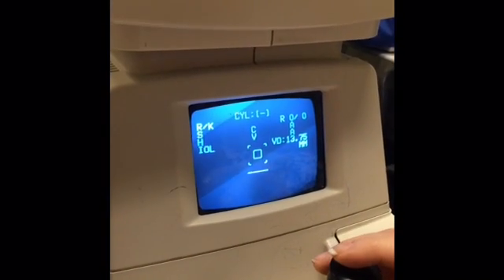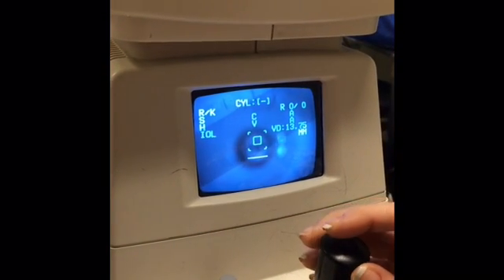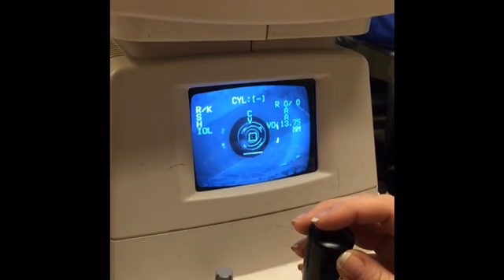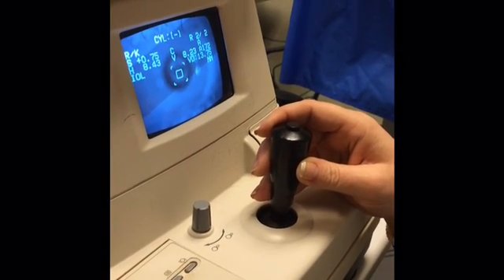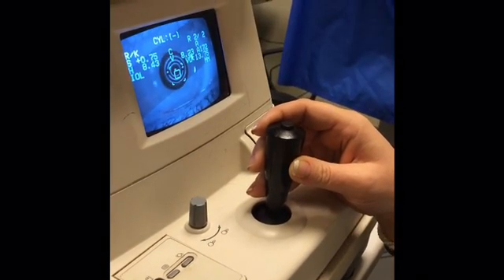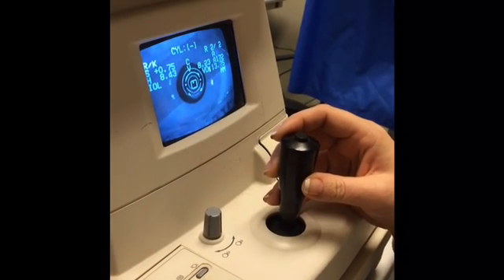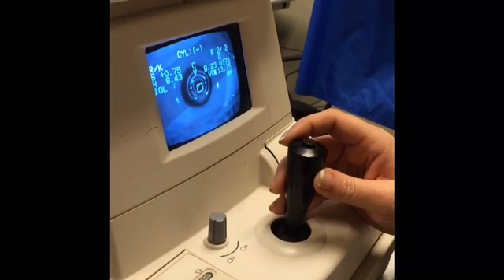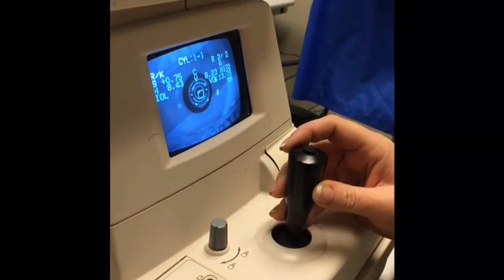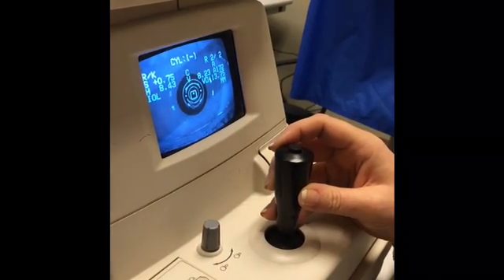Once you have adjusted the chin rest, it's time to move forward until the eye comes into focus. Using the platform and the joystick, slowly move inward towards the eye until the mires become in focus. If you go too far in, the mires blur. Too far out with the joystick and platform, they blur as well. So slowly move in until they become clear.